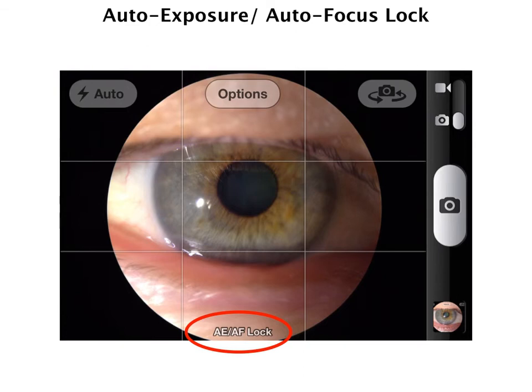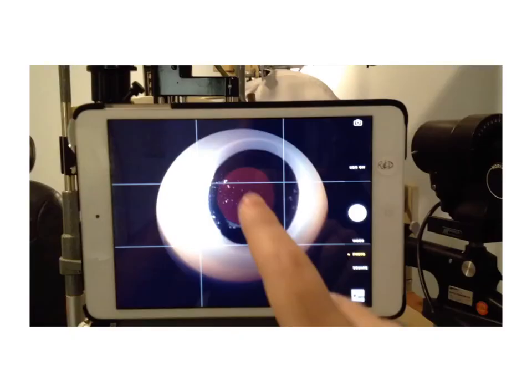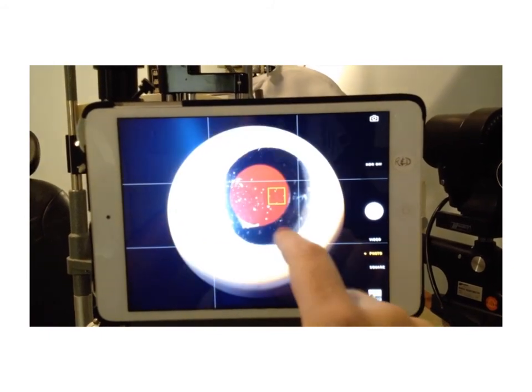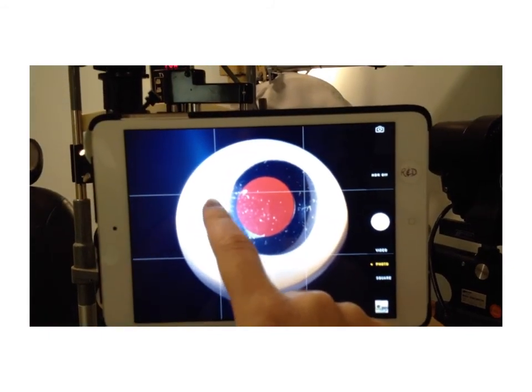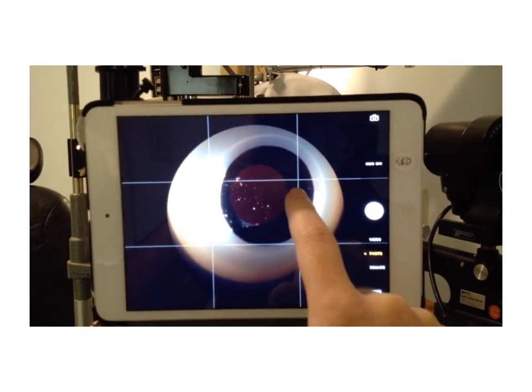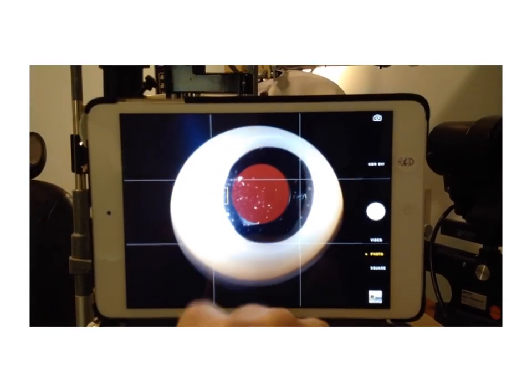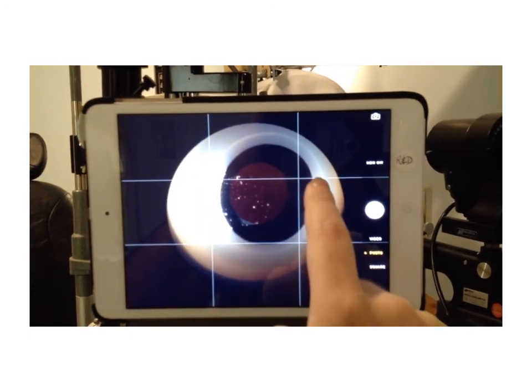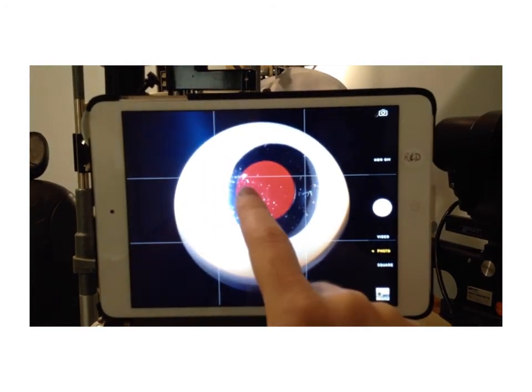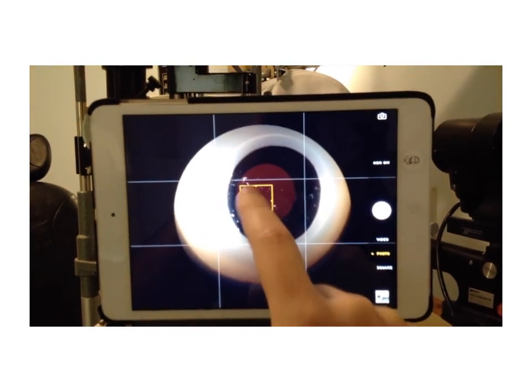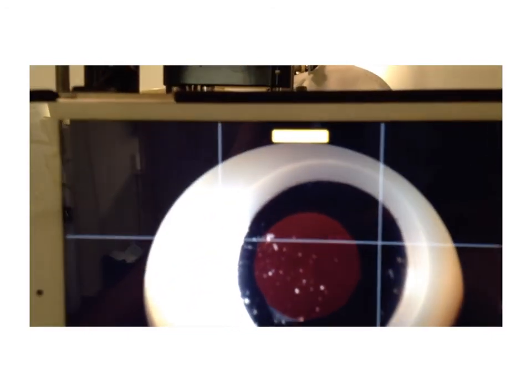The way you lock exposure is by holding down on the screen where you want to set it. In this video, I put up a model eye on the slit lamp with a slit beam coming in from the left side. When you tap on the darker area, it increases the exposure; when you tap on the very bright area, it decreases the exposure. Once you find the proper exposure — usually in the center of the photograph — you hold it down, it blinks, and that sets the auto exposure lock. You'll see in the upper part where it says AE/AF lock.